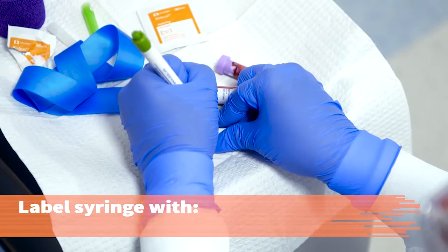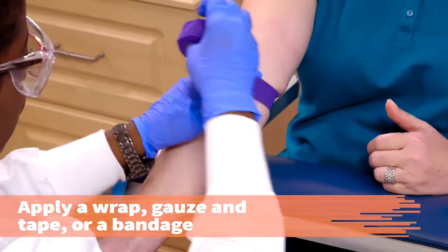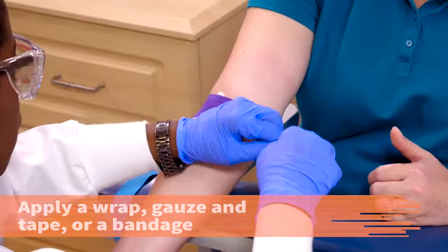While the patient is applying pressure to the site, label the syringe with the patient's name, date and time, and your initials. Or, affix the pre-printed tube labels and print your initials on the label. Check the venipuncture site to make sure bleeding has stopped. Apply a hypoallergenic self-stick wrap, gauze and tape, or bandage.